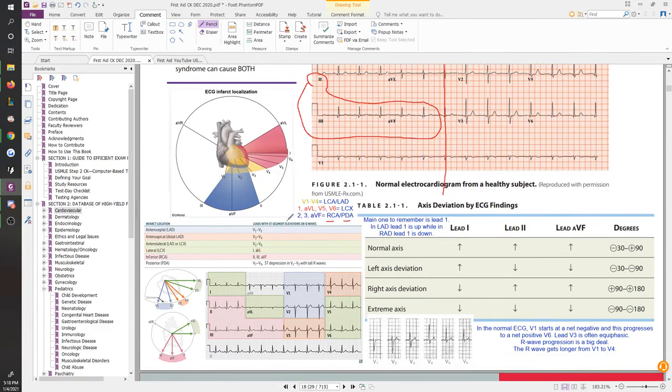So thankfully, 2, 3, and AVF actually look at both arteries at the same time, essentially, right? So this is going to check for an inferior MI and check for whether these arteries are involved, because if they are, then that would also imply that you're not going to have good supply to the SA and AV nodes, and that's not going to be very good for you. So this will tell you how to further evaluate the patient in terms of treatment. The yellow and the red is basically showing you exactly where the leads are placed.